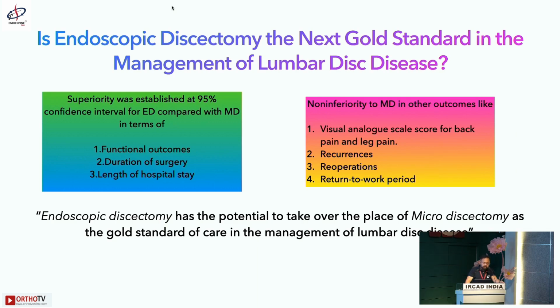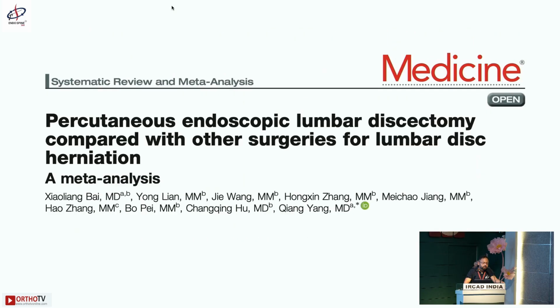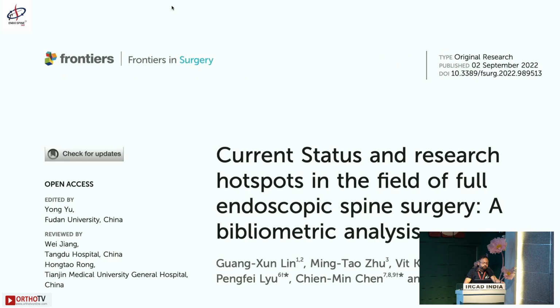Return to work period was almost similar in the final follow-up after 9 months. So, this proves that endoscopic discectomy has the potential to take the place of microdiscectomy as the gold standard of care in the management of lumbar disc disease. So, this is one more paper.